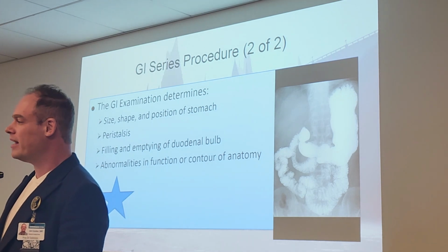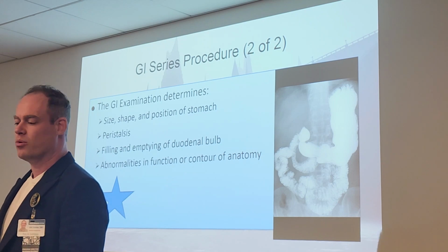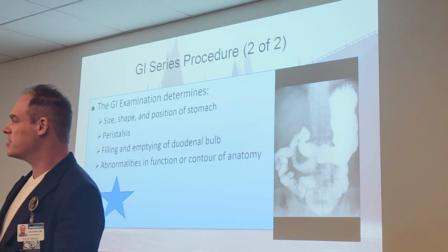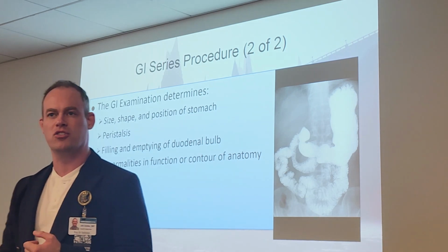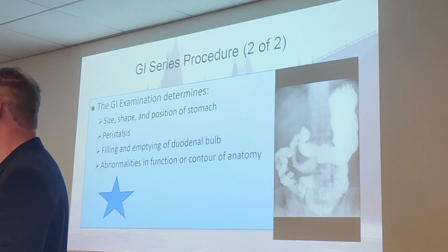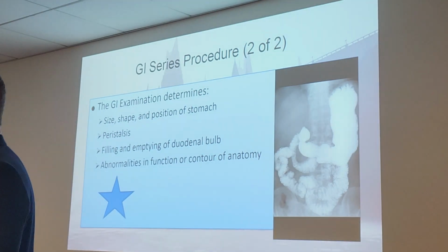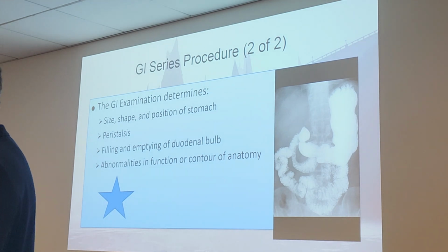I should have put this all in red, but it's a gold star slide of what we're actually doing for an upper GI. We're evaluating the size, shape, and position of the stomach, peristalsis, the filling and the emptying of the duodenal bulb, and abnormalities in function or contour of the anatomy, things like polyps, ulcers, deformities, perforations, so on and so forth.